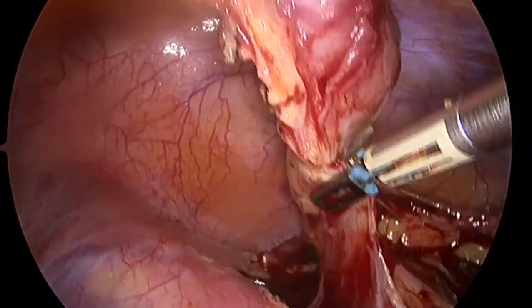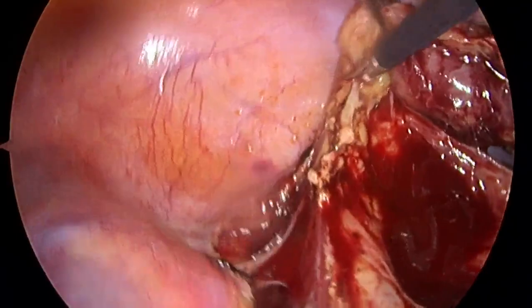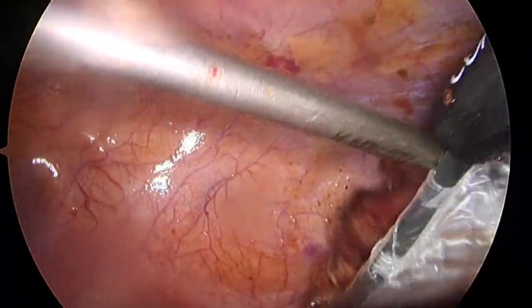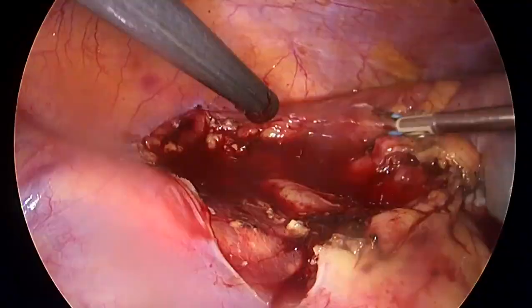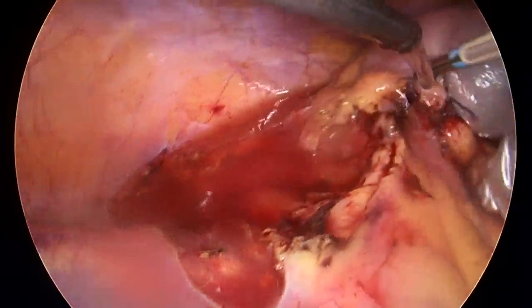Although it requires some technical skills, retrograde appendectomy with intracorporeal tie is safe, feasible, cost-effective, and extremely useful in selected cases of difficult appendicitis. It should be part of the armamentarium of any general surgeon.